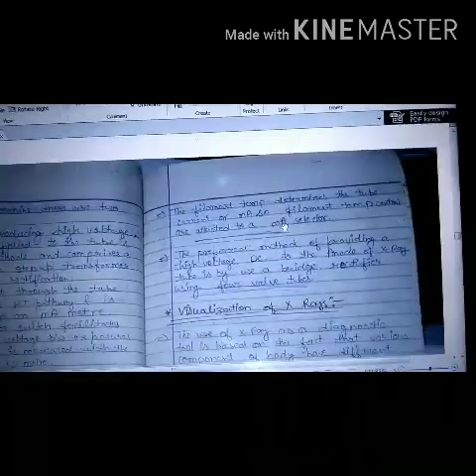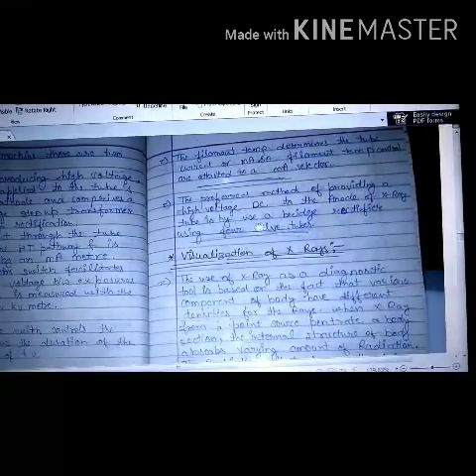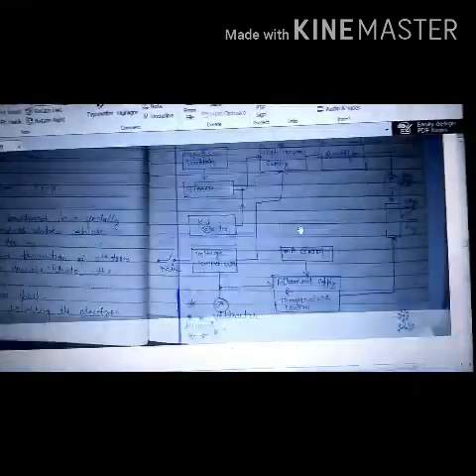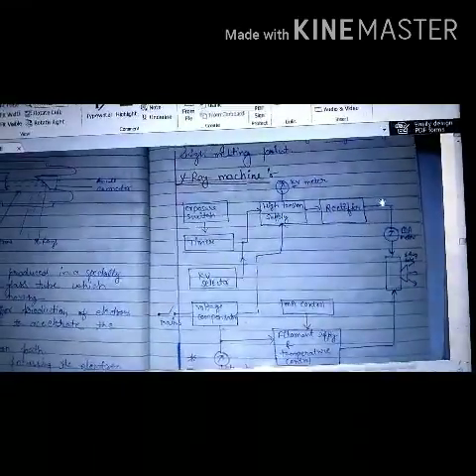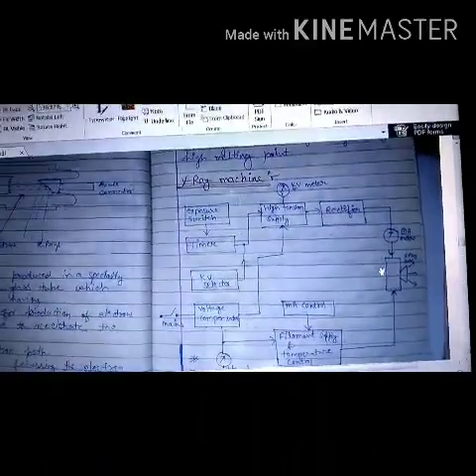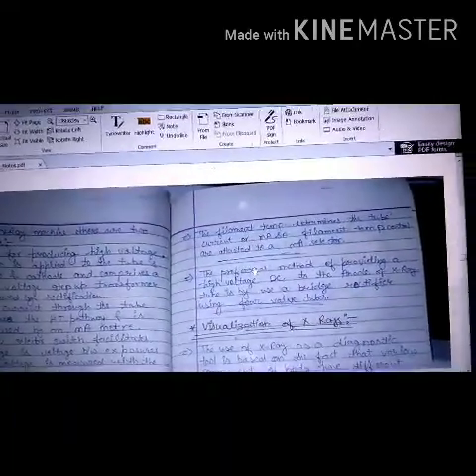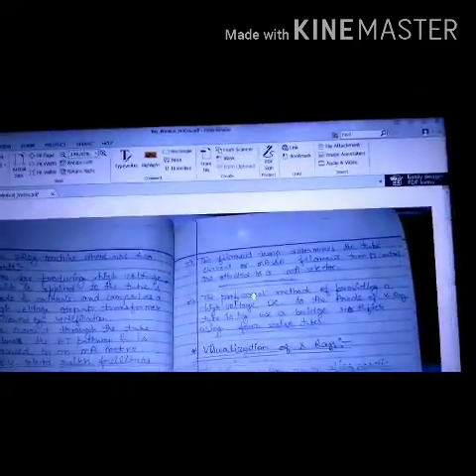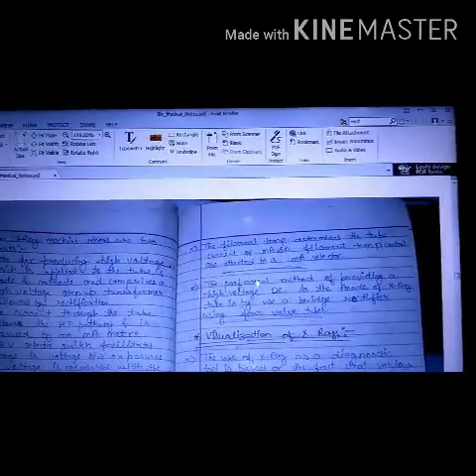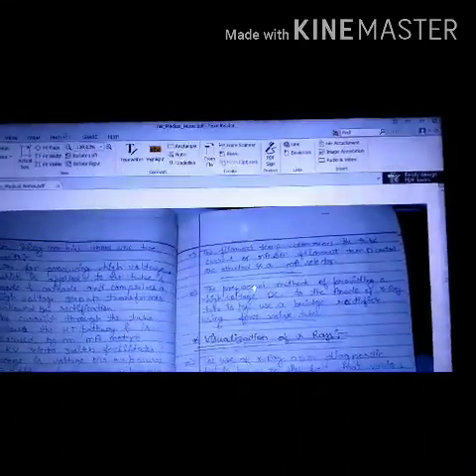Okay, then finally, the preferred method for providing a high voltage DC to the anode of the X-ray tube is by the bridge rectifier using 4 diodes. So we are using a rectifier here which is producing a direct current to this X-ray tube through which the X-ray will be generated. In this way the complete X-ray machine functions and it can be utilized for a particular application. Next we will see visualization of X-rays and its utilization in different applications. Okay, thank you.